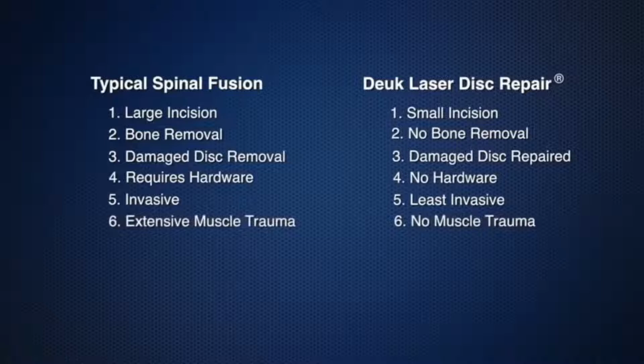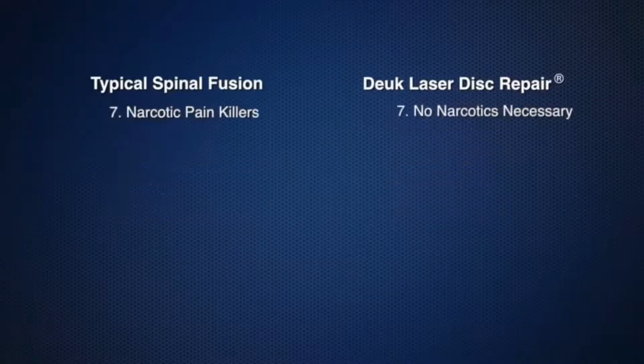Whereas with the Deuk laser disc repair, there is no damage to the muscles. The Deuk laser disc repair is the least invasive surgery available to repair a damaged disc. With spinal fusions, patients are required to take highly addictive narcotic painkillers, which can cause constipation, bowel, and bladder complications. Due to the minimal pain, narcotics are not needed with the Deuk laser disc repair.